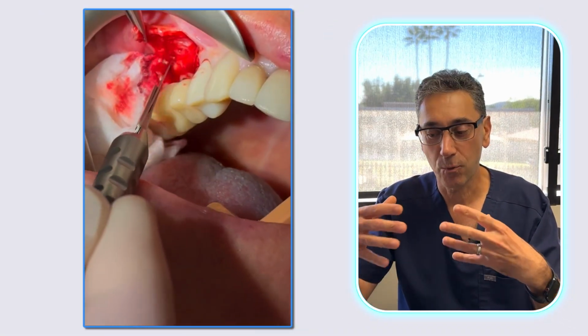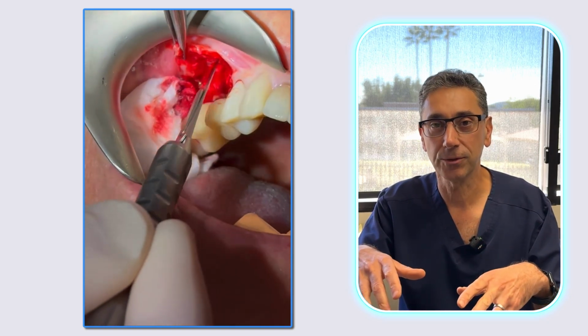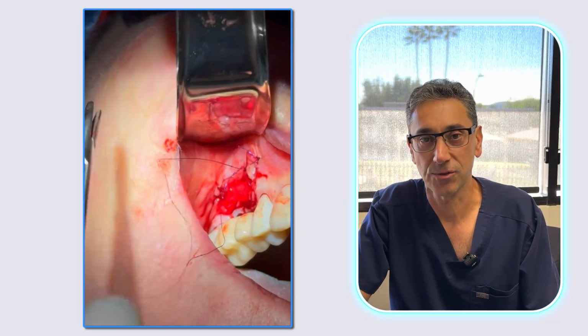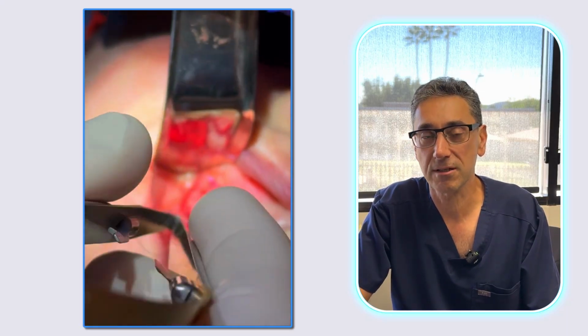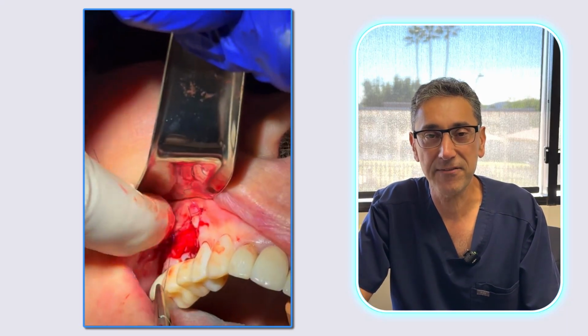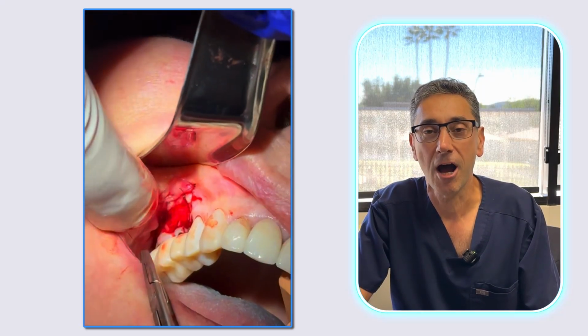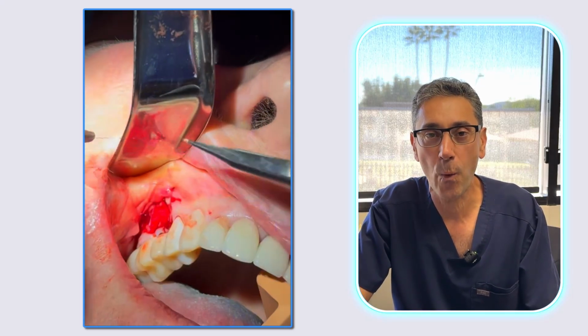When I'm taking that tissue out and putting it on the recipient side, I have to reestablish the blood supply for the tissue, and that's what we're going to do. If you've seen on the video, what I'm trying to do is create a recipient site for that tissue. So we're removing the epithelium. I am removing all those muscle fibers. It's a very, very gentle movement of the scalpel. By the tip of the scalpel, I'm stretching and removing all of those muscle fibers away from that area.